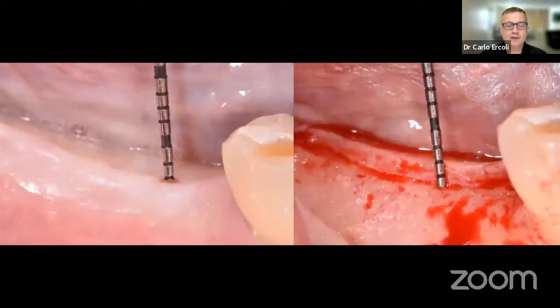So if we look now, instead, at the thickness of the soft tissue that we have, and this is just in the posterior area, you can see that very often that tissue is actually not thicker than 2 millimeter. So you start wondering, if my biologic width, my cuff of soft tissue around that implant, will be formed and will have roughly a 3.7 to 4 millimeter thickness, how is that tissue that's only 2 millimeter thick going to react? What is going to make that type of biologic width possible?